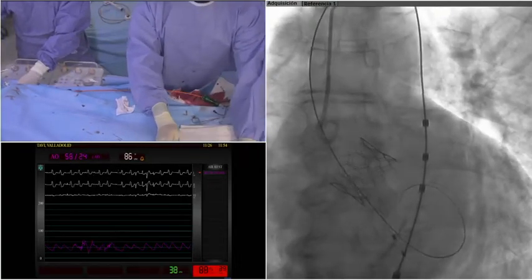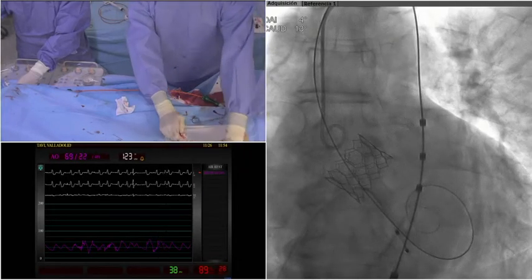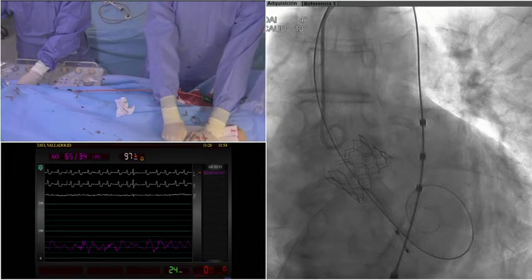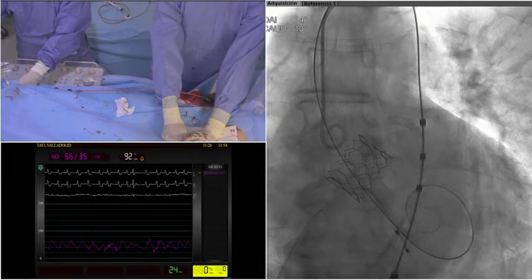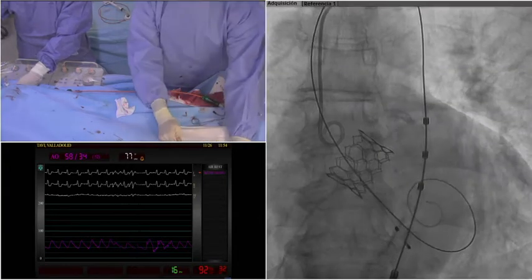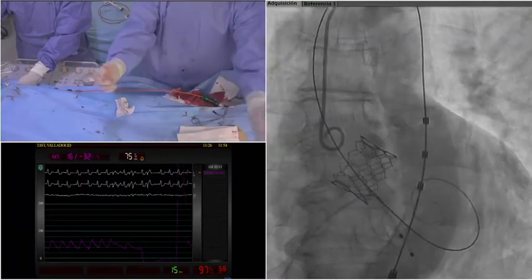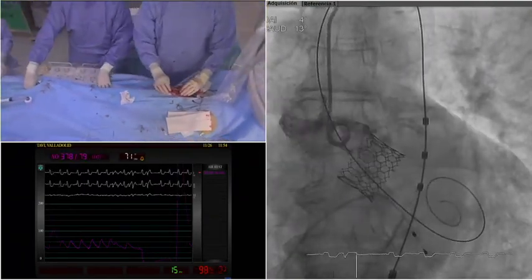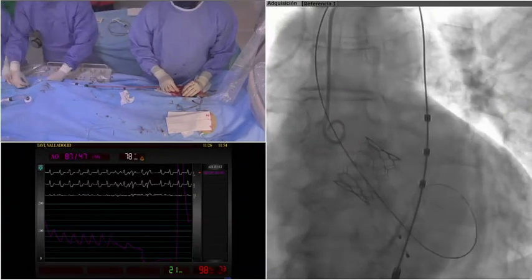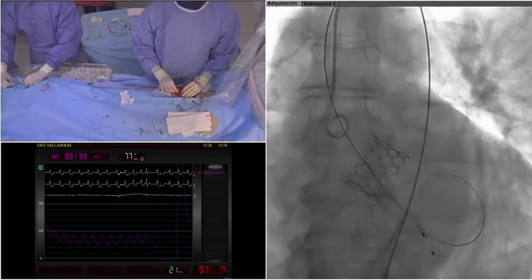I'm going to check that everything is fine, even if this angio will not be perfect. Sube un poco más, 8.16. Well, we see the pressures going up. Okay. Cine. We leave the balloon there just in case we need to post dilate, but it seems all correct. So yes, well, actually, it's good. I think the other one could be removed now if you wanted to do it.